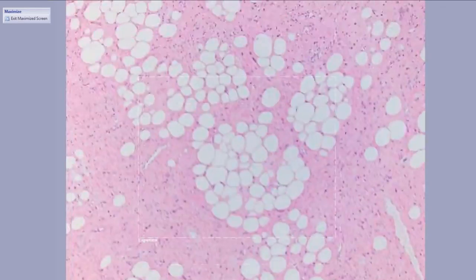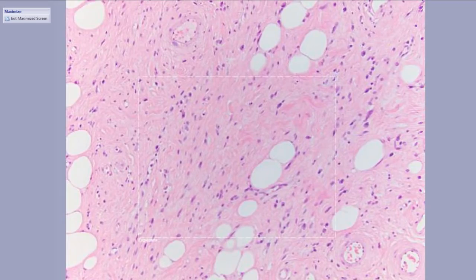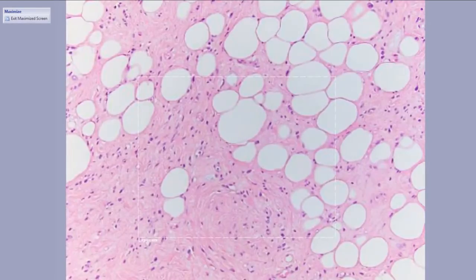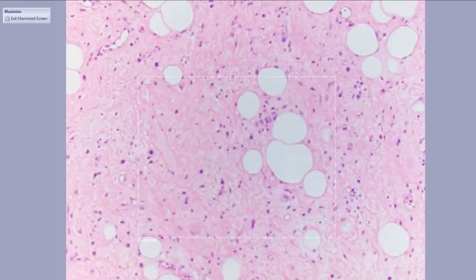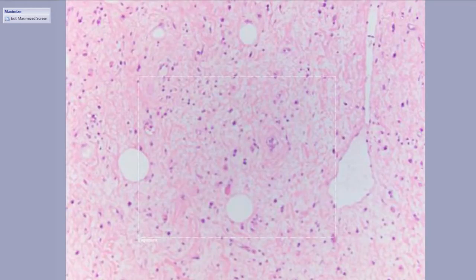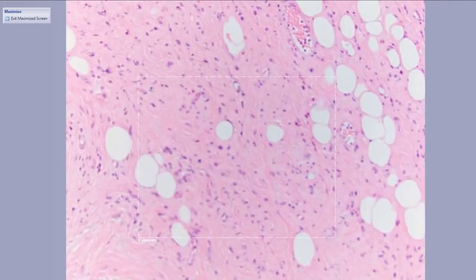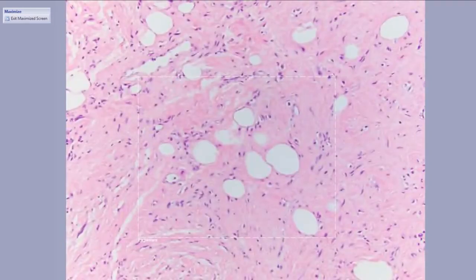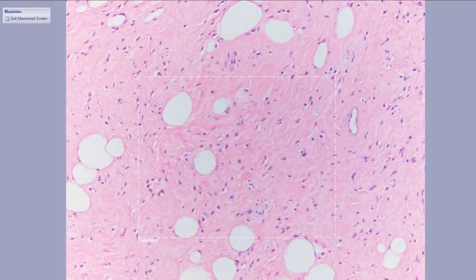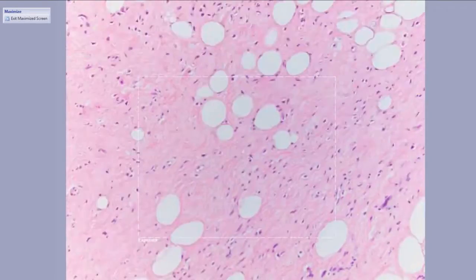If we look closer, we can see that it's fairly bland. There's some inflammatory cells, mast cells, and if we look for a while, there are occasional atypical cells. Of course, I'm not finding them right at this second, but they are here. So for a long time, this was a lesion known as giant fibrovascular polyp of the esophagus. But in the past couple years, a group at Mayo Clinic realized, hey, these look kind of funny. These look a little atypical.